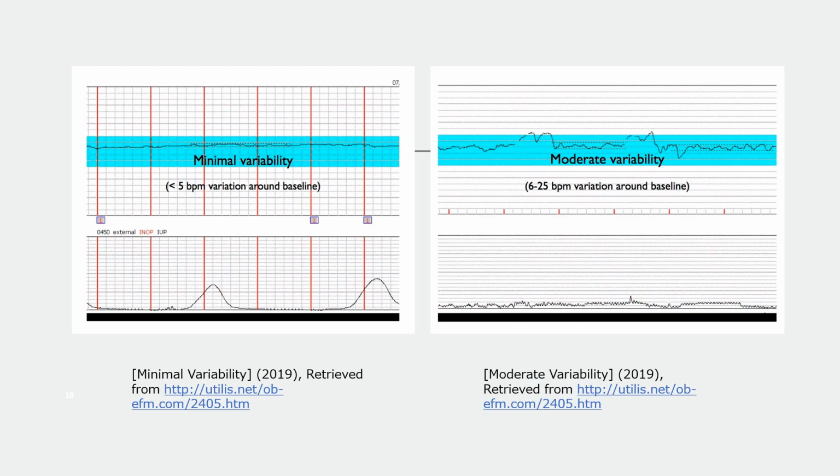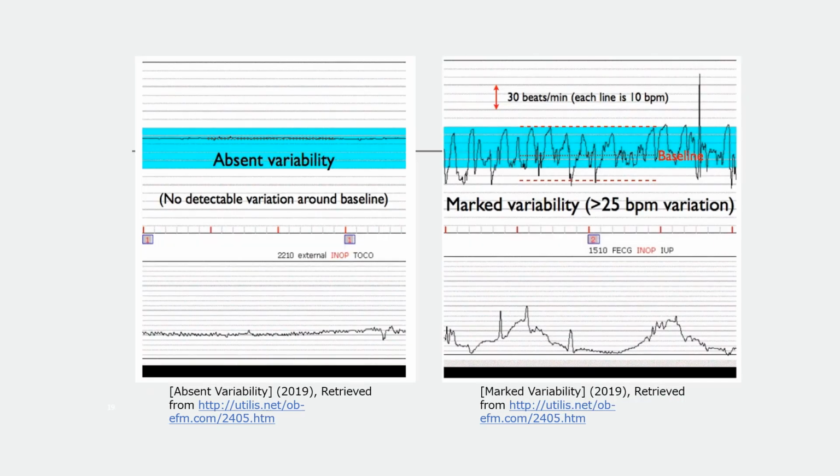Okay, absent, as I said before, this is a dying baby. This is a tracing where the patient walks in the door, probably complaining of no fetal movement or decreased. This patient will get delivered ASAP.